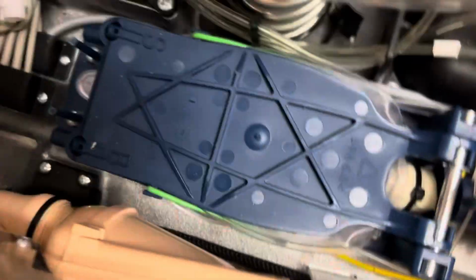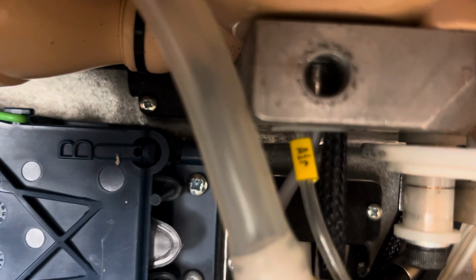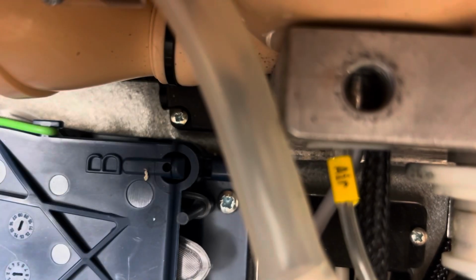Next thing I do, and this is really important, is that, so you can see where it's making contact there. It'll come through, and there'll be a sort of ridge where this will slide into. And it'll allow rotation, but not allow it to come off. Always hand tighten this. I'm going to pull back and forth as I'm turning this clockwise to tighten it. You can see it's not coming off.